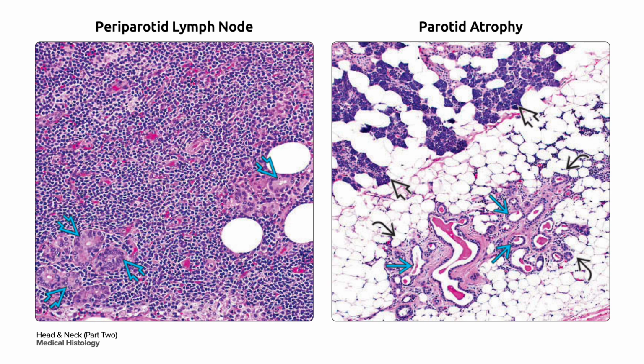On your left, similar to the intraparotid lymph nodes, the periparotid lymph nodes also may contain salivary gland inclusions in the bold blue arrow, likely due to late embryologic encapsulation as well. These may mimic metastatic disease and can be a source of extraparotid salivary gland neoplasms.